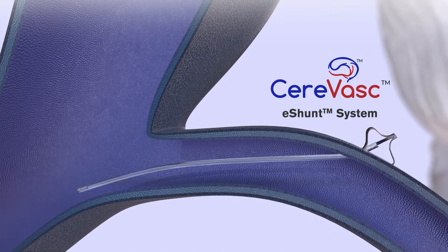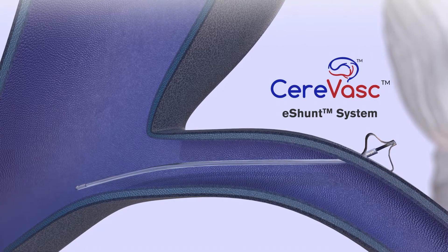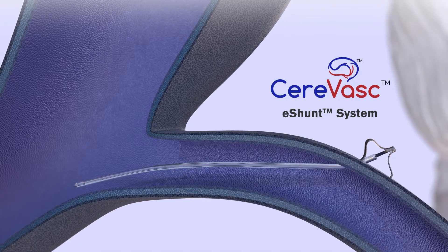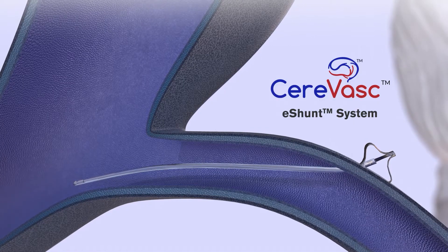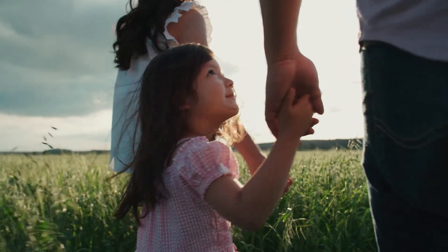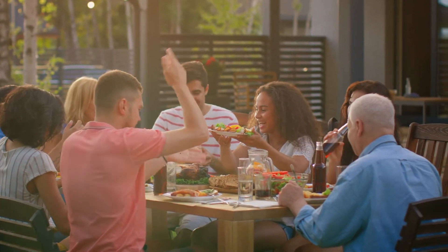The eShun system is being developed to offer healthcare providers an alternative minimally invasive method of treating communicating hydrocephalus, a condition of excess cerebrospinal fluid accumulation in the brain. The eShun system consists of endovascular delivery componentry and a permanent implant that shunts cerebrospinal fluid from the intracranial subarachnoid space to the venous system. This novel treatment approach has the potential to significantly improve patient outcomes and substantially decrease the overall cost of surgical treatment of this life-threatening condition.